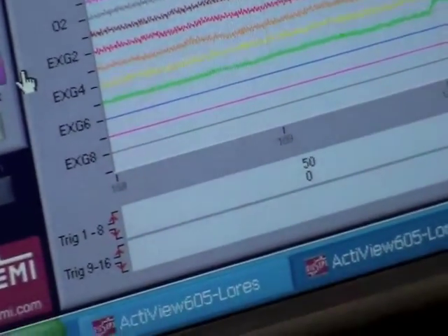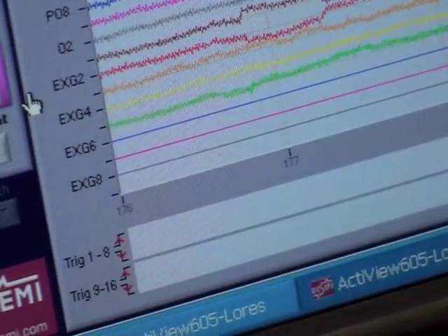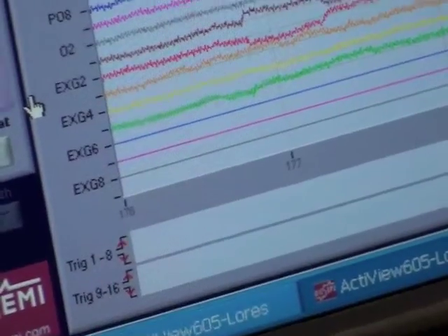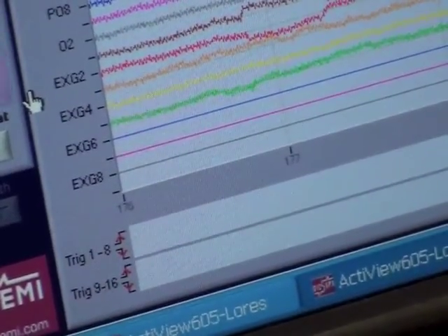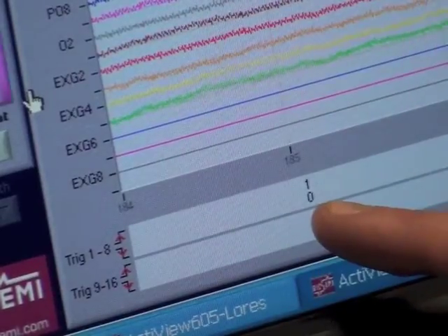Okay. So I'm going to run this again to show you what I'm seeing, to make sure that everything's running correctly. Sorry, I have the experiment run very short because I was just showing it to a lab. Usually this would go on for hours. So Bren's watching this, okay? On the bottom of the screen, as each image comes up, a 1 came up, that was my own face, a 1, my own face, a 1, my own face.